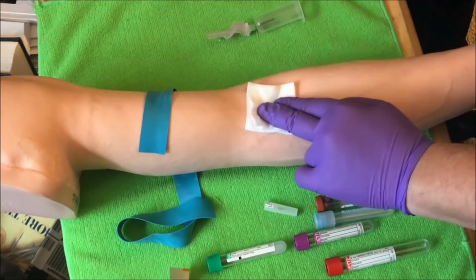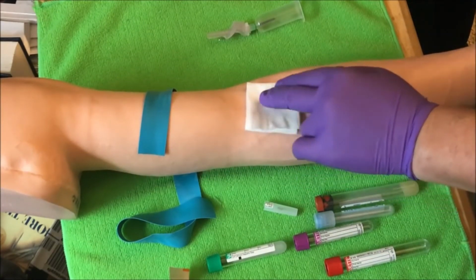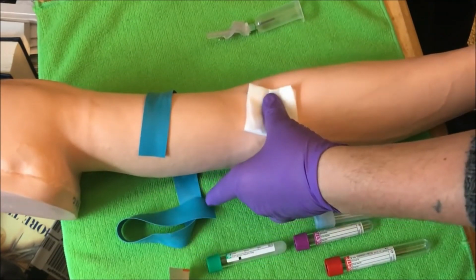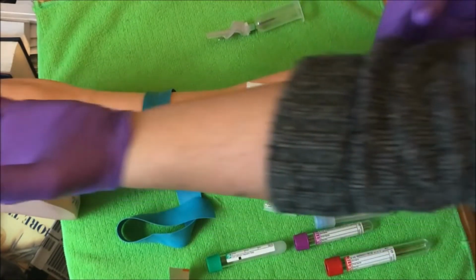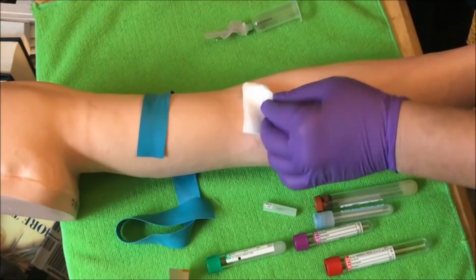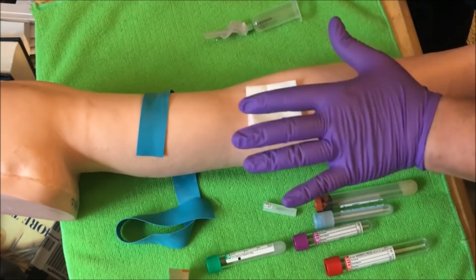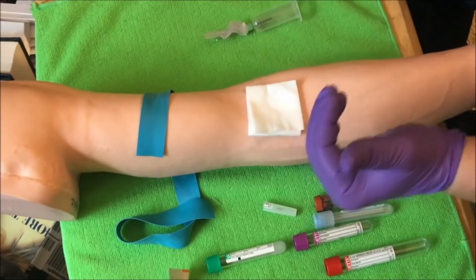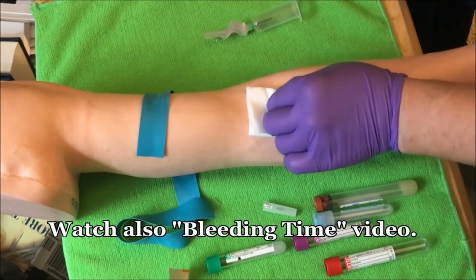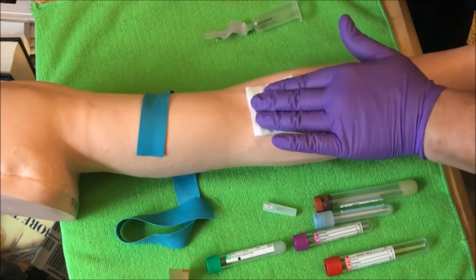Now, if you look at my post-care instructions video, where I talk about what I do next, you should have watched that video on post-care instruction. I leave pressure on here with the patient either putting his own thumb, gripping it right on his arm, or he can put his own 2 fingers on there. I come back 3 to 5 minutes, checking, making sure it stopped bleeding. If it's still bleeding, I go another 3 to 5 minutes. If you watch my 3 Ps, you'll know why they could still be bleeding. So once I check 3 to 5 minutes, it's good, no blood flow, it's not bleeding, plus over, I use gauze.